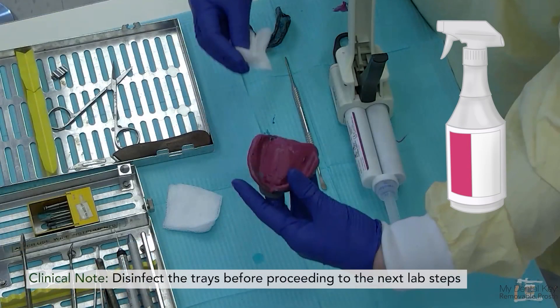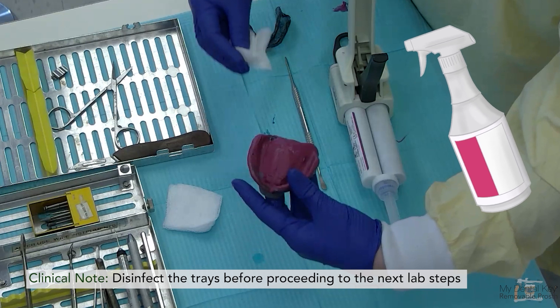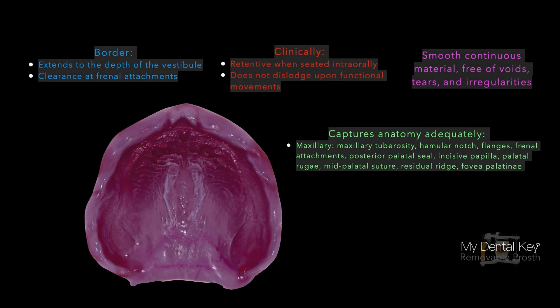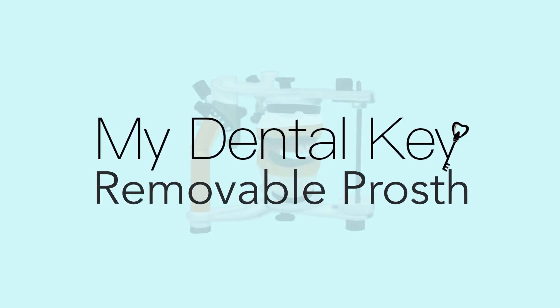Disinfect the impression and impression tray after you are satisfied with the impression, prior to sending it to the lab. Review our checklist to ensure that your maxillary final impression adequately captures the anatomy of the maxilla and does not have any voids, pulls, or imperfections in the material. Thank you for learning with us — please continue on to learn about the mandibular final impression or about pouring models from your final impression.